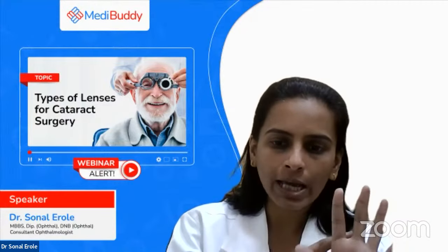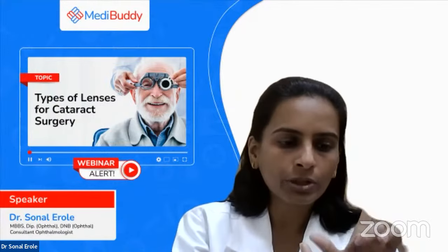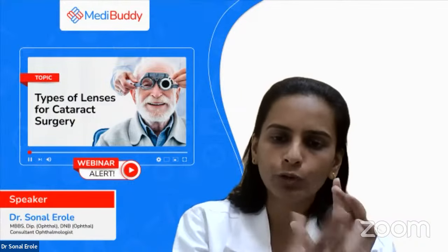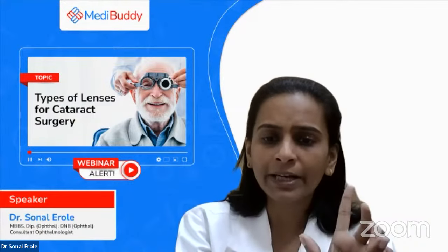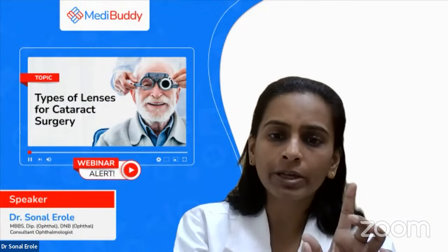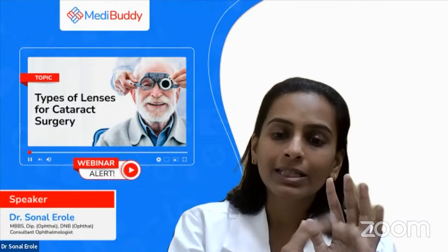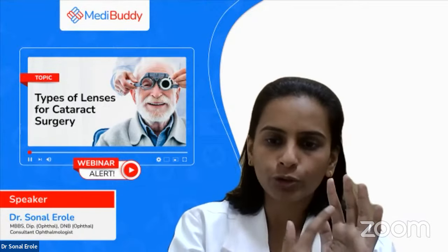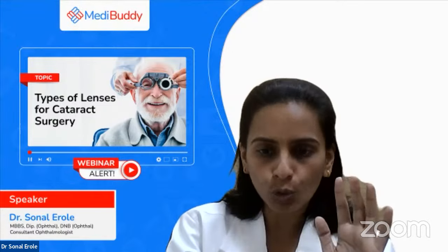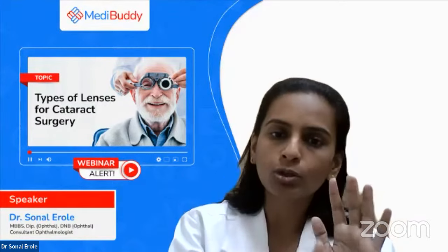Because otherwise, what will happen? These lenses will correct the spherical power of the eye. Even if you have a -5 or -6, these can be adjusted in the monofocal lenses so that you need not wear glasses for distant vision. But if you have this cylindrical power, then you need to have it in your lenses also. So what lenses do we have for this? These are the toric lenses. Toric lenses will have that cylindrical power in them.